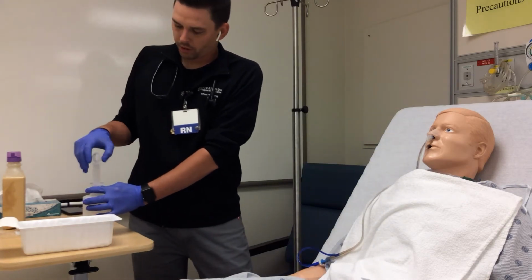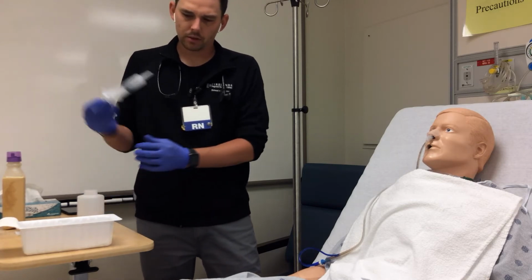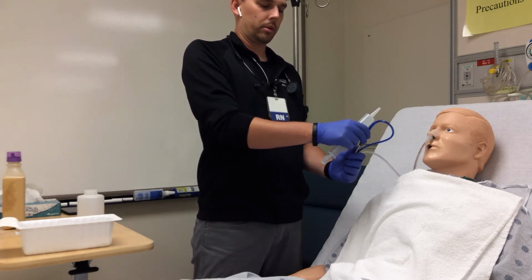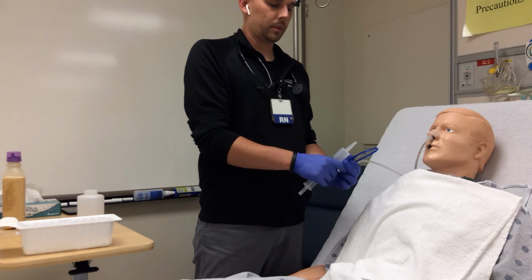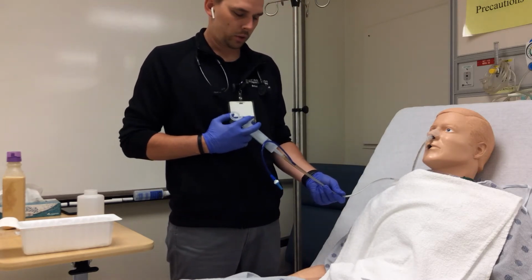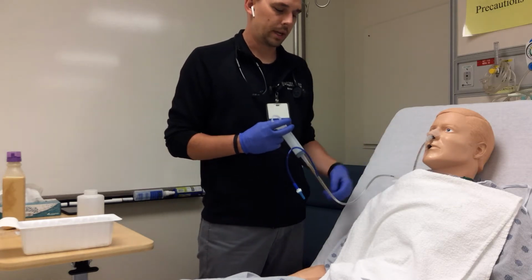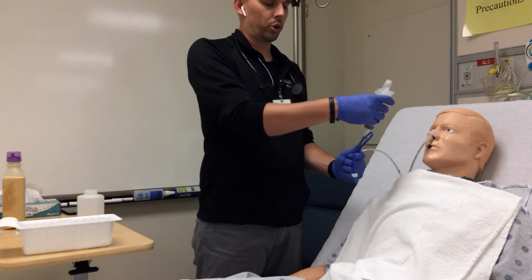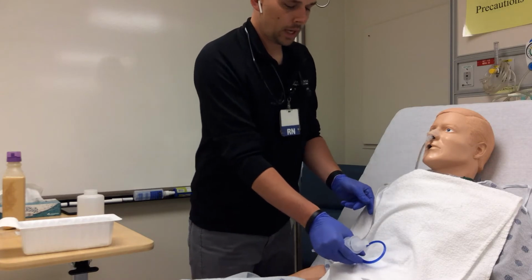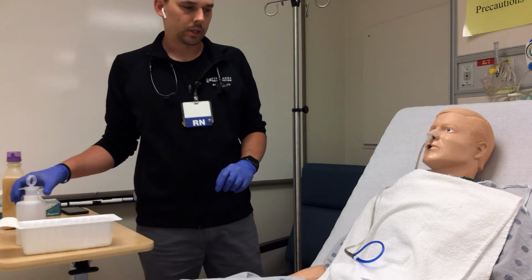Now I am going to draw up 30 mLs of water. Again, remembering anytime we are initiating a feeding, we have to flush before and after. So we'll clamp, remove the blue port, connect our syringe with water, and we're slowly going to infuse that 30 mLs to clear everything throughout that tube. Clamp one more time, replace our blue port, and we have confirmed placement, we have assessed gastric residual, and we're ready to initiate our feeding.